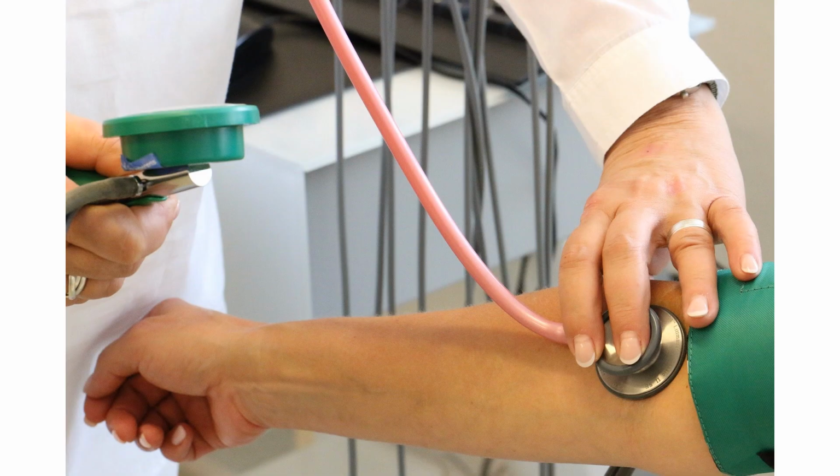The inflatable blood pressure cuff is usually placed over the arm above the elbow. Pressure in the cuff is raised using the bellows till the pulse felt at the wrist disappears. This gives an estimate of the systolic BP. The chest piece of the stethoscope is then placed over the inner part of the elbow below the BP cuff. The cuff is inflated again till the pressure in the cuff is well above the previously noted systolic pressure.